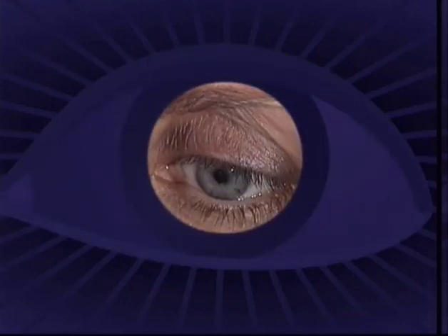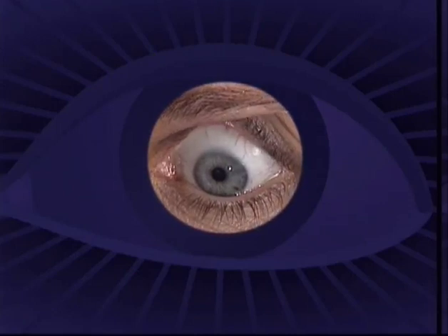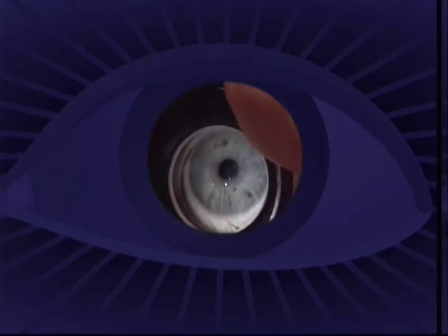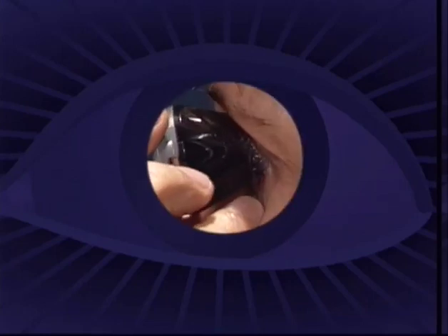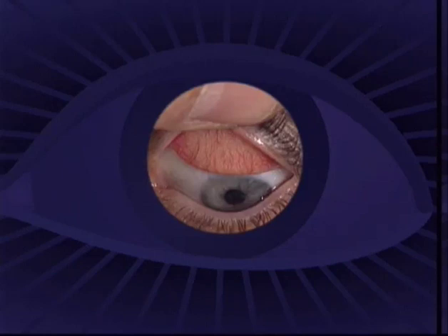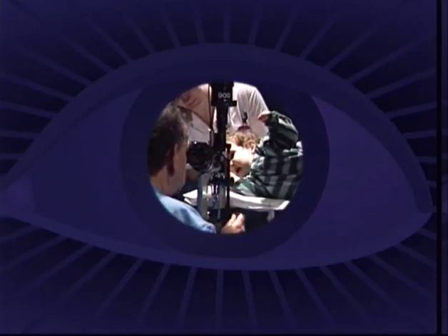This part of the tape will show the retraction of the eyelids. Methods for inserting a contact glass. Removal of the contact glass. The eversion of the upper eyelid. Adjustments for the examination of babies.